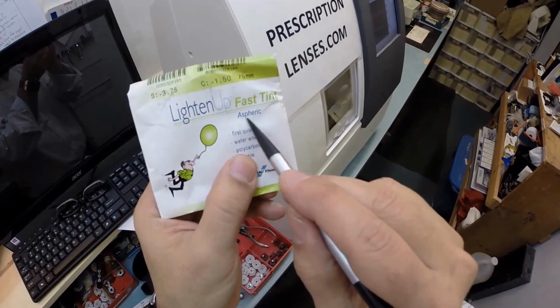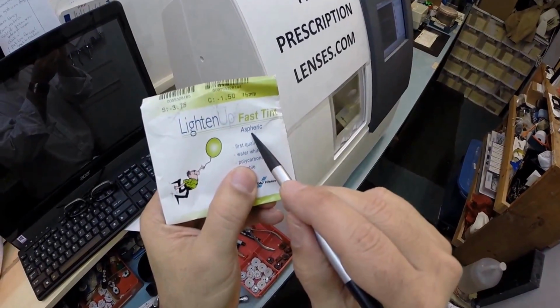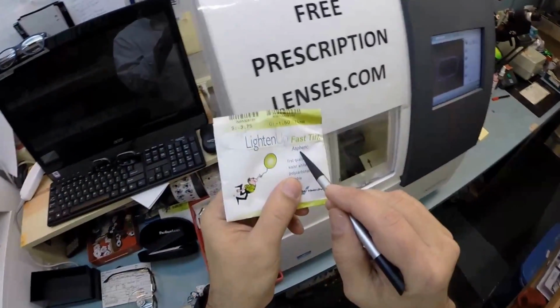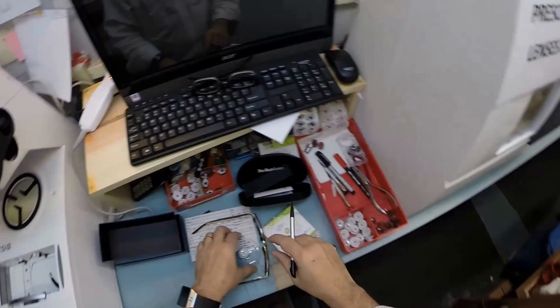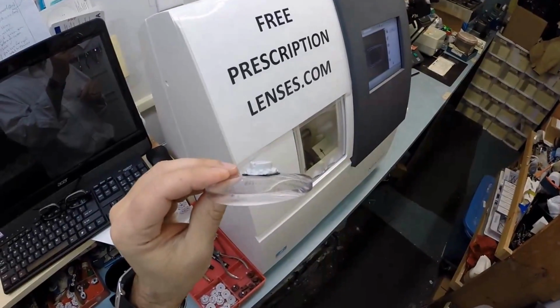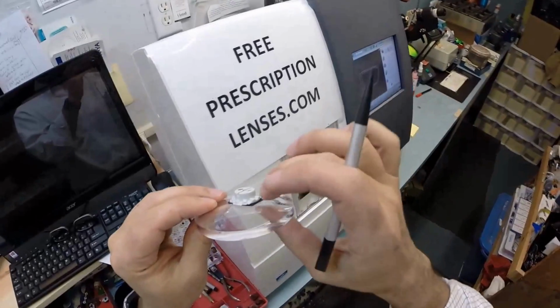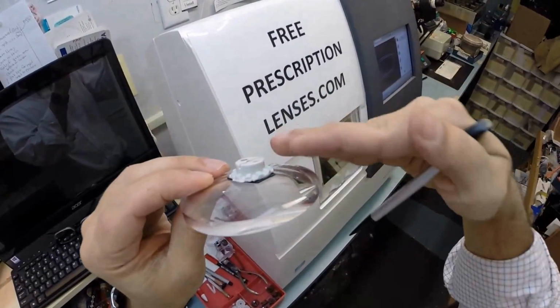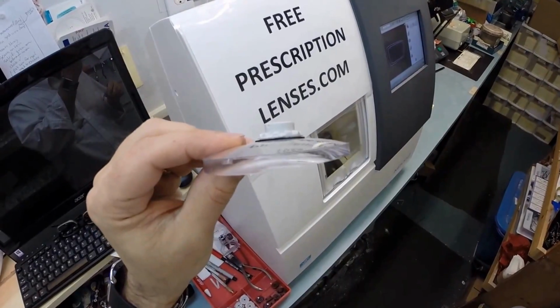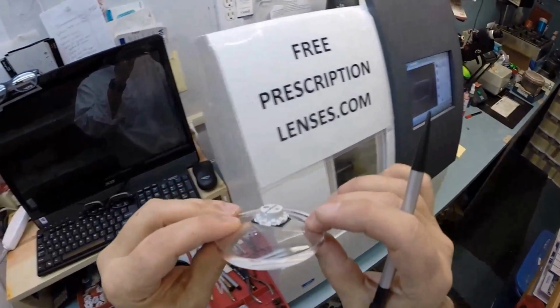Your lenses are also aspheric. Aspheric simply means not spherical. A sphere, like an orb, is completely round in every direction. Sometimes when you look at people's lenses, it's so round it gives you an ugly cosmetic fishbowl appearance. So your lenses are thinner, but the actual front curvature of the lens is much flatter. That gives you a wider field of view, plus a much better finished cosmetic quality.